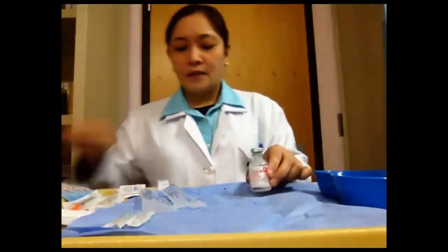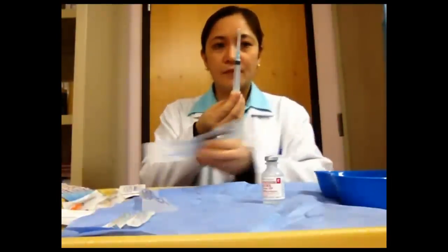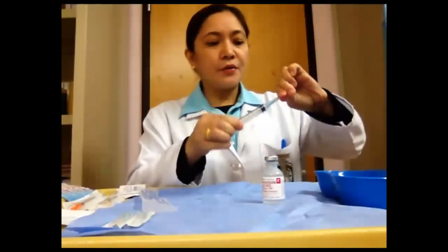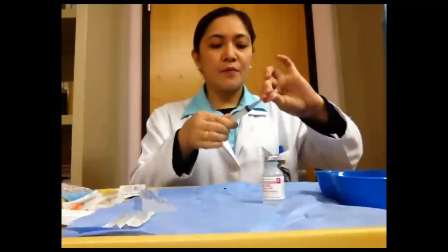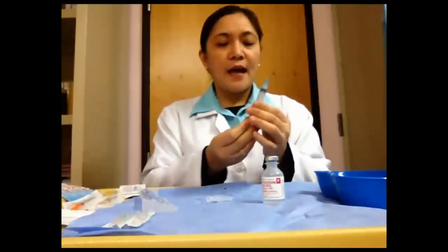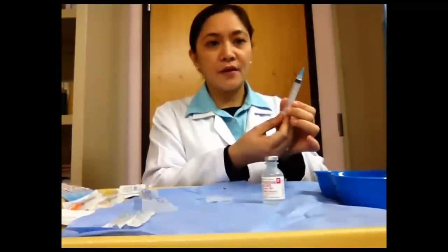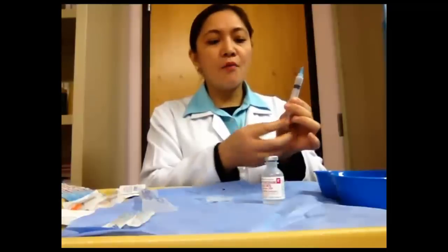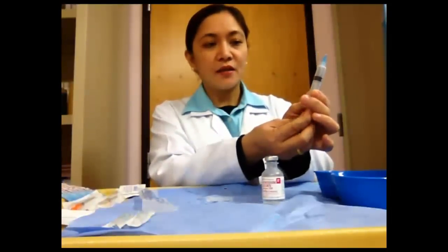Okay, and then get the syringe and secure the needle attached to it. Loosen the plunger. Remove the cover and draw the correct amount of air into the syringe. That is how much you will get from the vial. That's the amount of air you will inject into the vial.